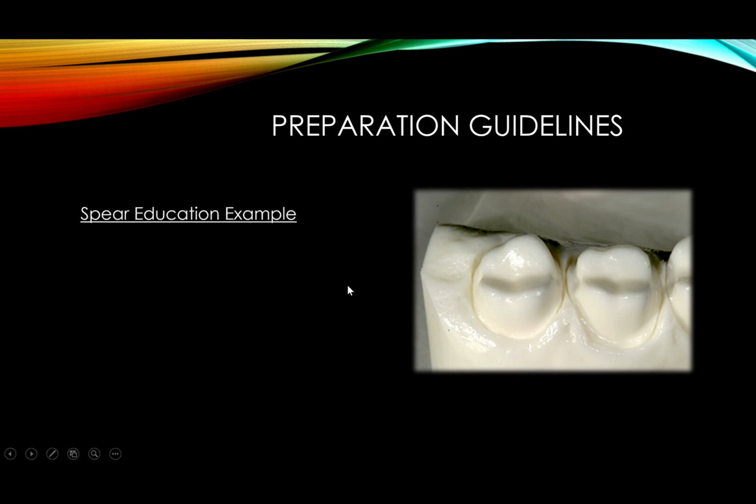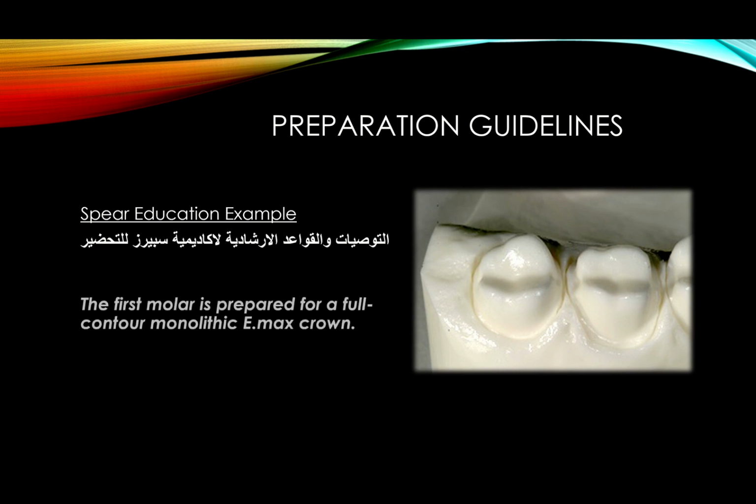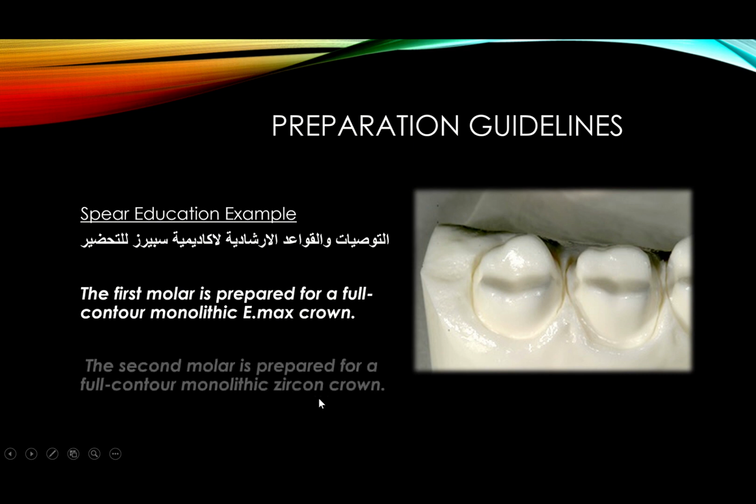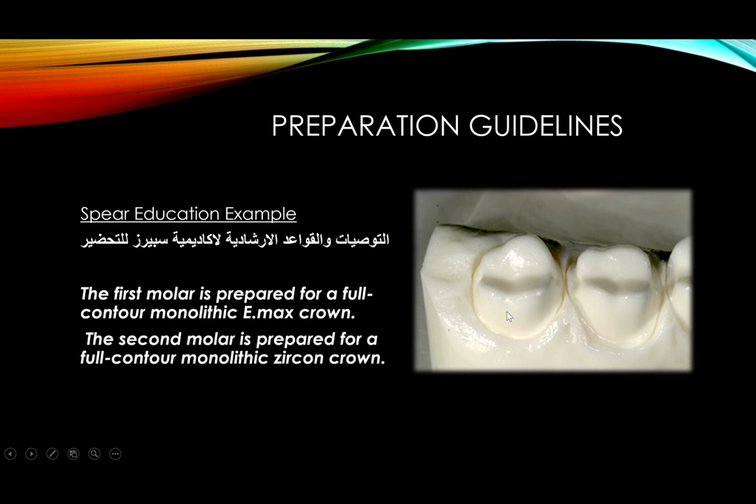So under preparation guidelines, I would like to show this example. It's a very important example from Spear Education. This example shows that the first molar is prepared for a full contour monolithic Emax crown. We established that we don't want to say Emax, we say lithium disilicate, but that's the way they published it. So number 6 here, the first molar, is prepared as a monolithic lithium disilicate, while the second molar is prepared for a full contour monolithic zirconia crown. Okay?